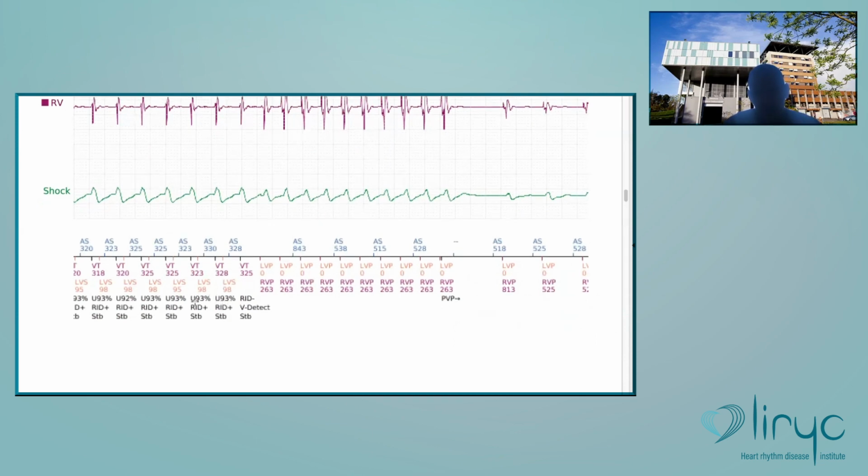Okay, but remember, 94% is probably too high. And if you program 85, 86, 87, at least, you will have much better results in terms of specificity and decrease in inappropriate therapies. Okay, the inappropriate therapy that I have seen in this case, most of the time there is a correct initial diagnosis, and then at one time, for any reason, for 10 beats, the quality of the signal is less, and then the patient will receive inappropriate therapy.